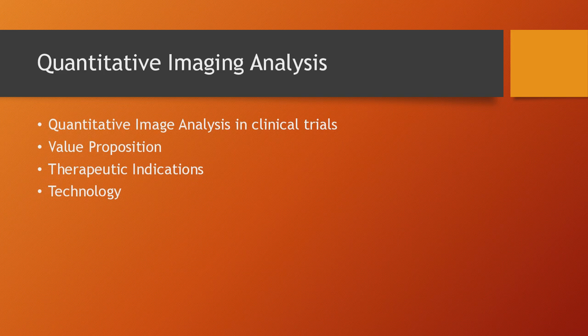So let's think about the therapeutic indications of quantitative image analysis. I think quantitative imaging biomarkers are so powerful because they are highly sensitive to small changes of treatment, right? We can monitor, for example, some days after a specific treatment in a tumor to evaluate if the angiogenesis is changing. For example, we can see it at 7 days after treatment of a specific lesion or tumor.